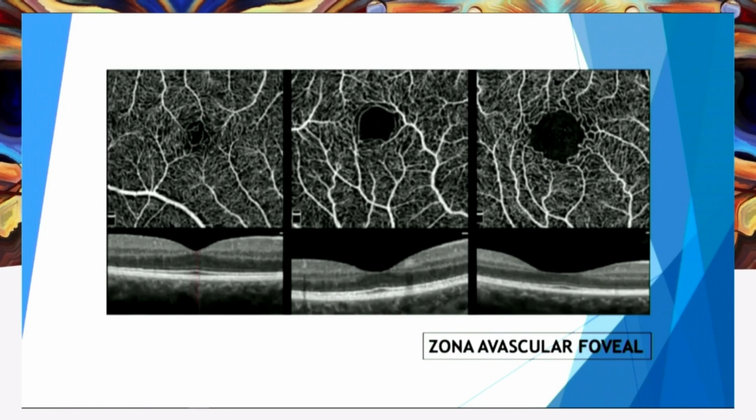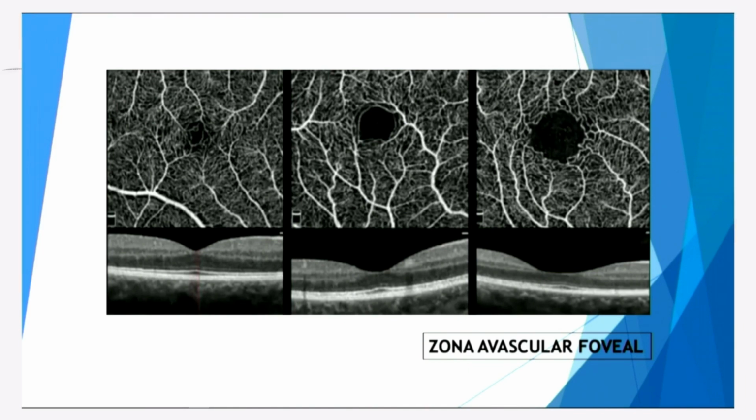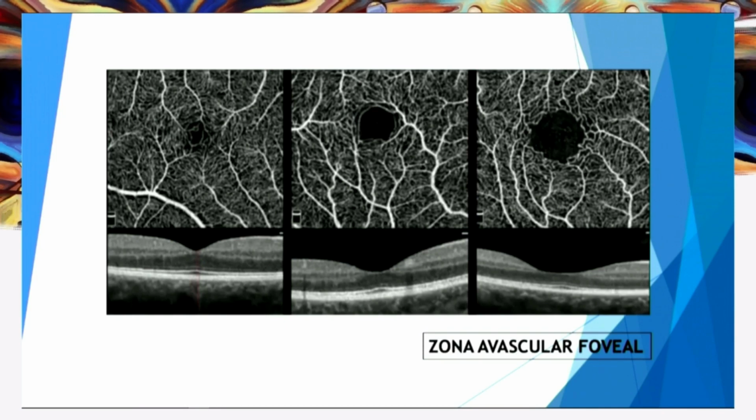It is important for us to always relate against the patient's anatomy, in this case, using the structural mode. If you see the foveal avascular zone in all three images, this is different. It differs in all three. You could say this and this. Well, the patient must be diabetic. There is increase of the foveal avascular zone. But if you take a closer look at the center of the macular area on the fovea, in all three, they are different.